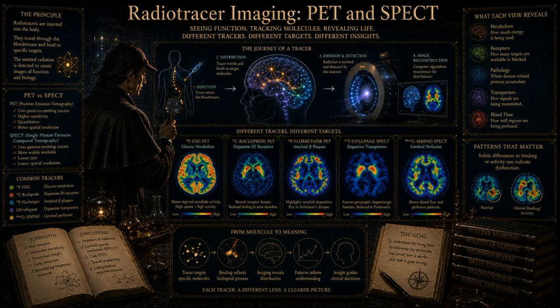20 minutes. Let's translate that to reality for a second. If I have a vial of carbon-11 tracer, half of the radioactive signal is completely gone, decayed into stable boron, in the time it takes me to drink a cup of coffee. Yes, and another half of what remains is gone 20 minutes after that. This means you cannot order a carbon-11 tracer from a commercial pharmacy in another state. You must have a particle accelerator, a cyclotron, physically located on the premises of your imaging center, often in the basement directly below the scanner.